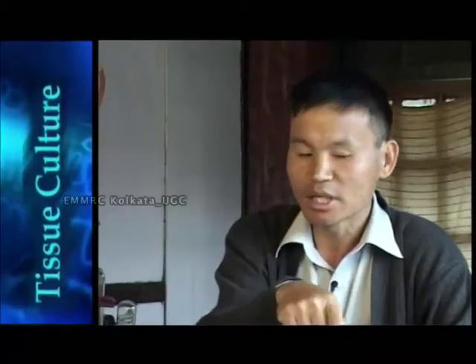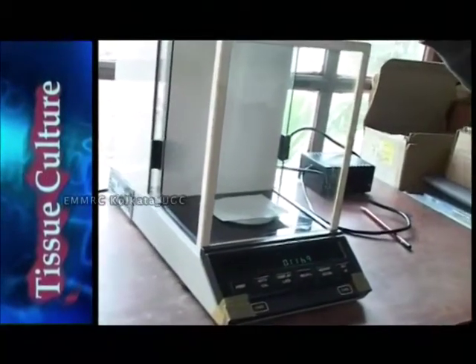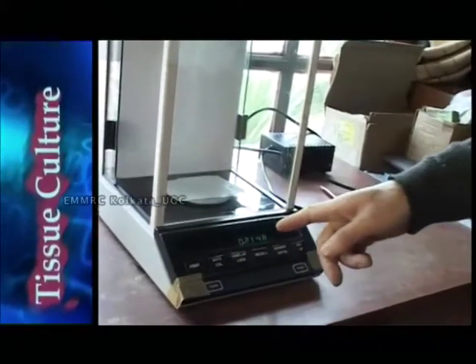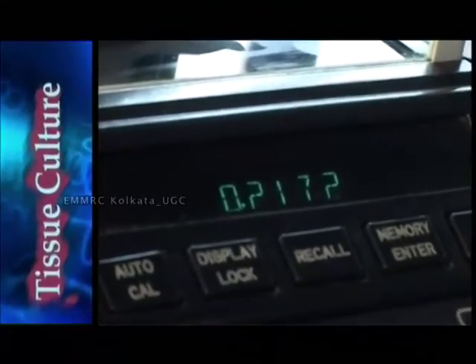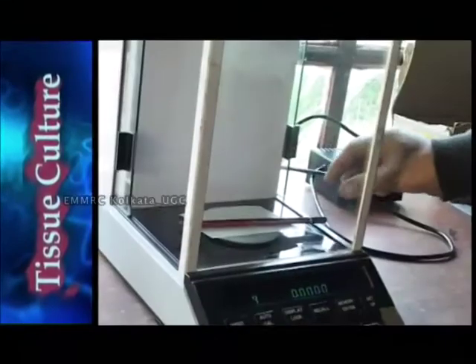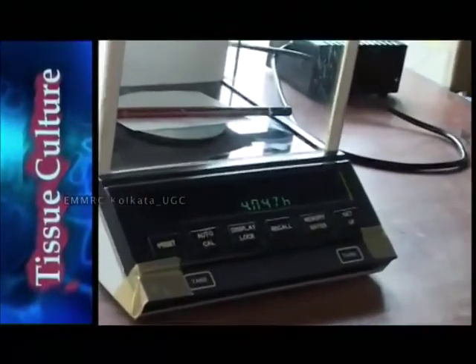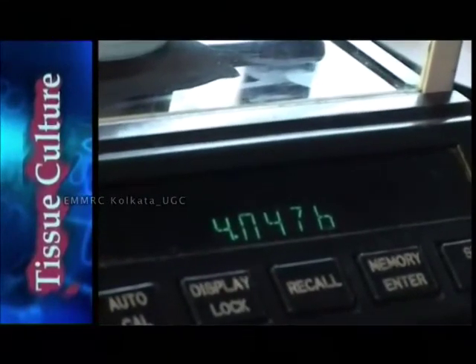If you are not doing that, you have to buy the different chemicals, and for that you need a good balance again, because here you have to weigh out 10 milligrams, or sometimes 20 milligrams, or sometimes even 1 milligram, a very minor quantity, which is very difficult to get from an ordinary balance. So you need a good electronic balance.